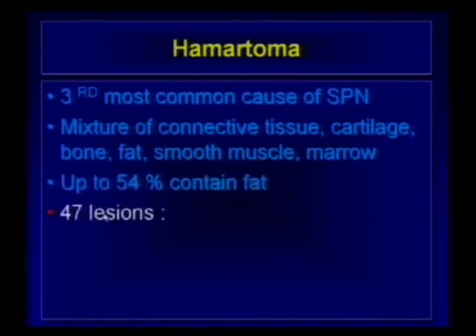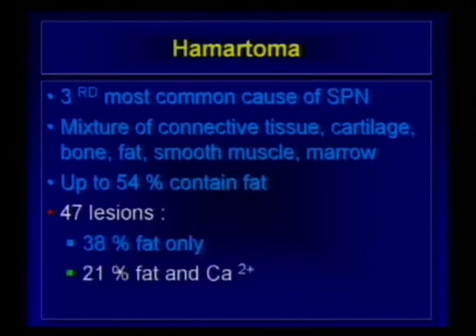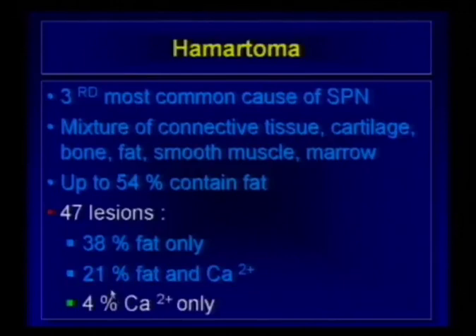47 lesions studied at Hopkins in the 80s. 38% had fat only, 21% had fat and calcium, and 4% had calcification only. Again, like I mentioned before, that calcification may have a chondroid pattern, and I'll show you a lesion like that shortly.